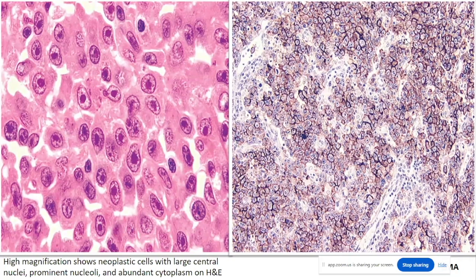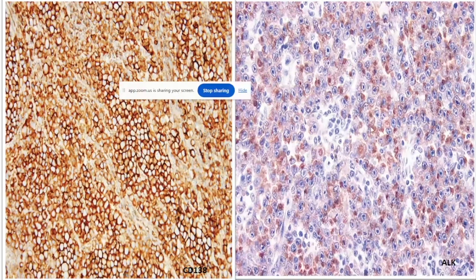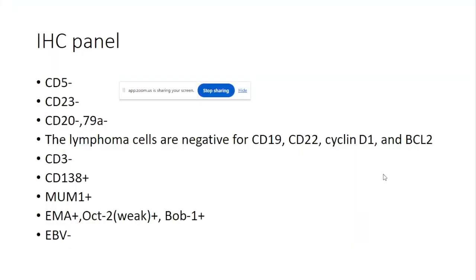A single nucleolus and plasmacytoid appearance can still be seen very clearly. This image shows EMA, which is positive in this case. CD138 is also positive. Someone also performed an ALK stain — let's discuss the interpretation. An IHC panel was done, and I've shown images of some of the markers.